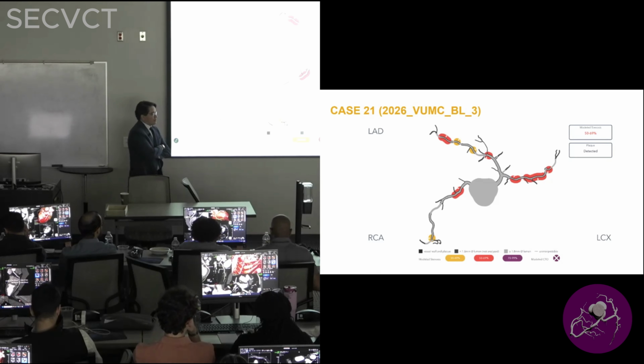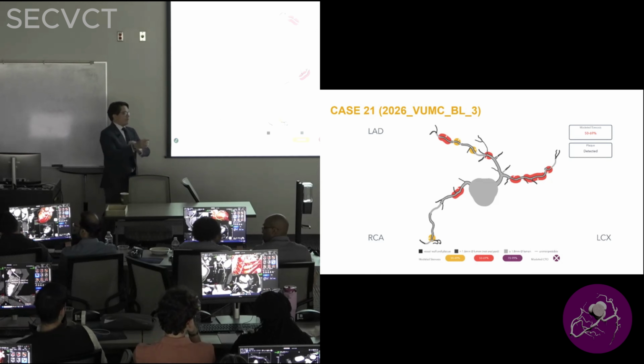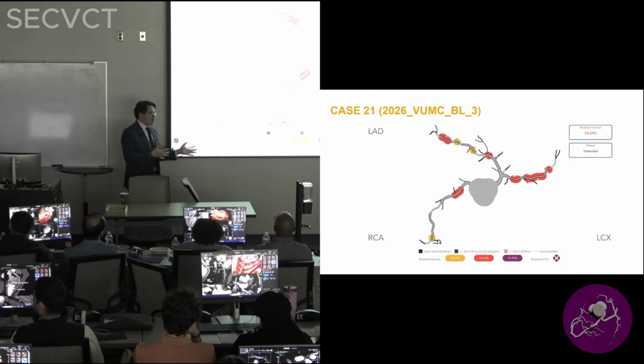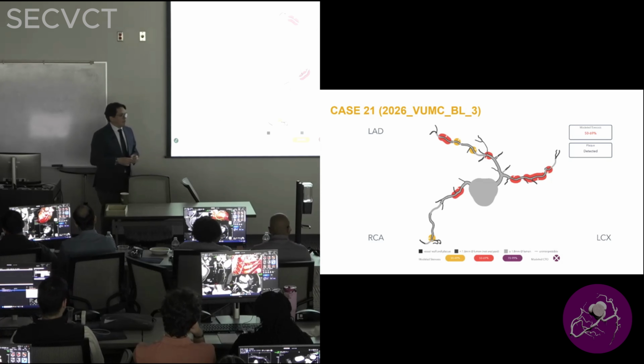That's a great question. So there are a few tricks. We do the higher kernels, the sharp reconstructions. We can see if in the sharp reconstructions we still have severe. In the end, it might be really challenging in those patients with very high calcium scores, especially if you don't have a photon counting CT at your disposal. And that's kind of a limitation of the technique, right?